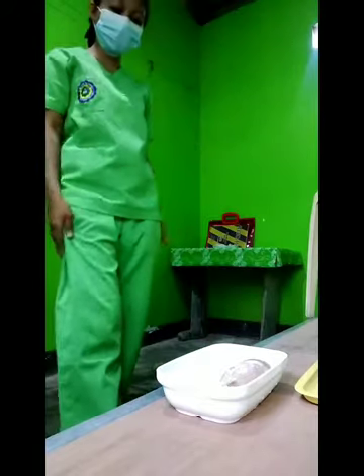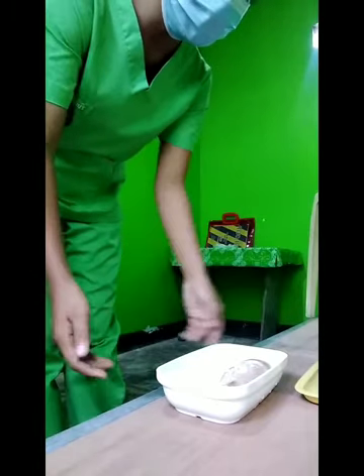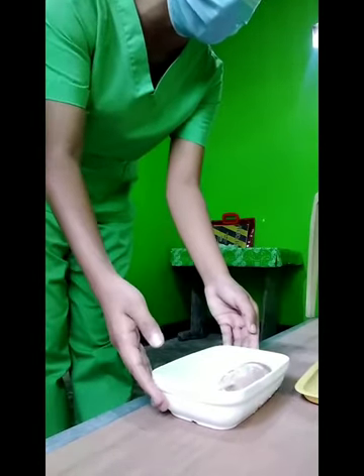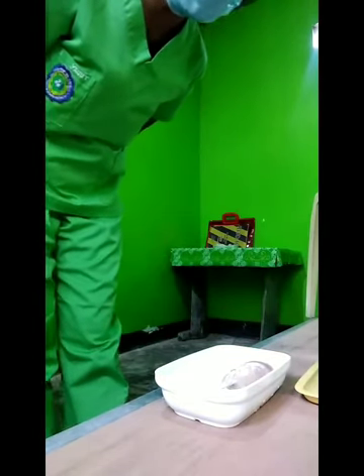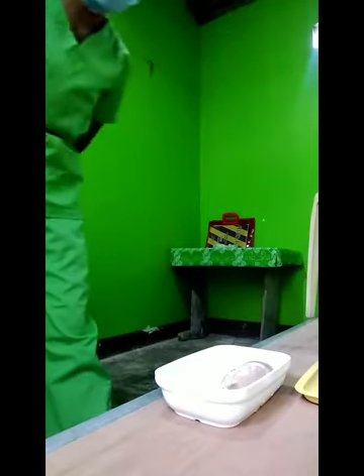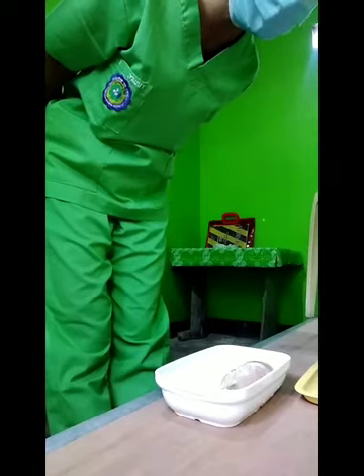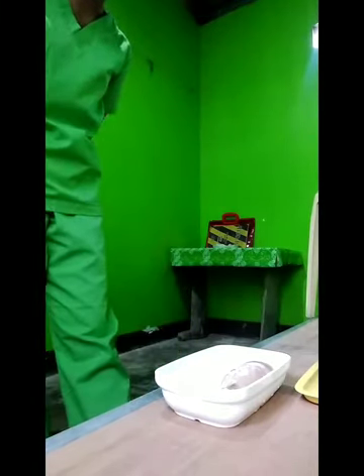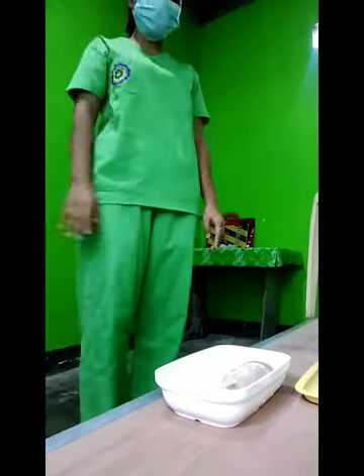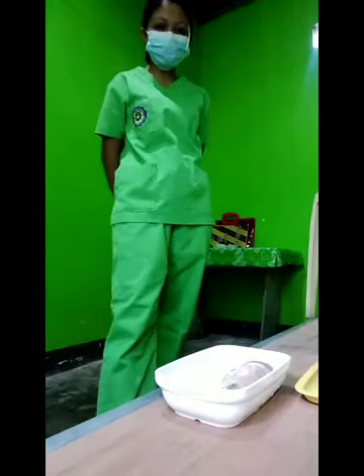Then, identify the patient, checking the name and identification number of the patient's identification band. Ask the patient to state his or her name. If the patient cannot identify him or herself, verify the patient's identification with a staff member who knows the patient for the second source. Then, close the room or the bedside curtain.